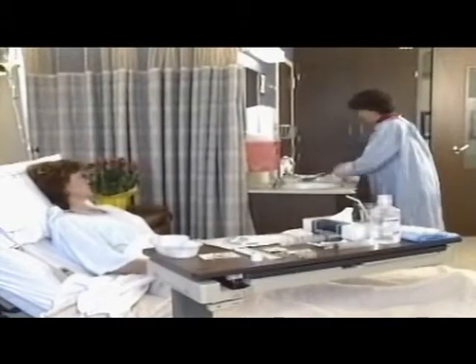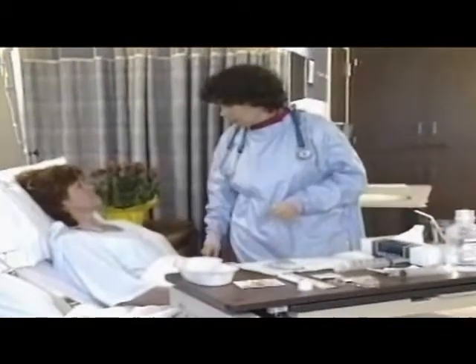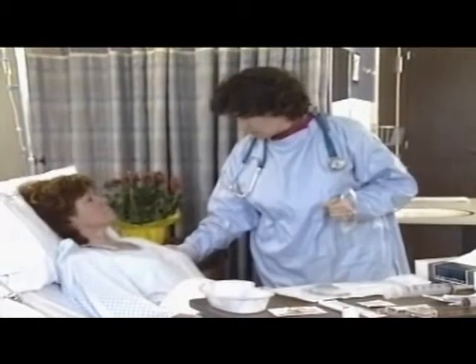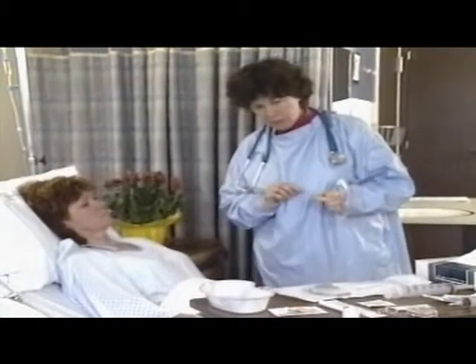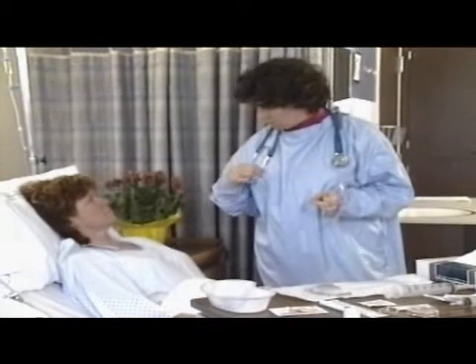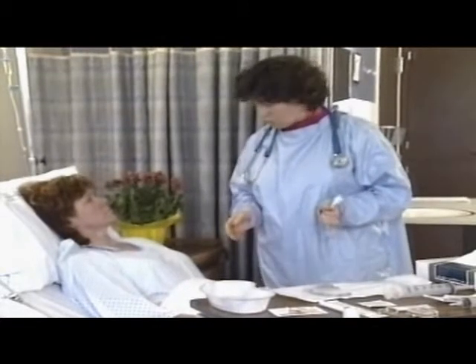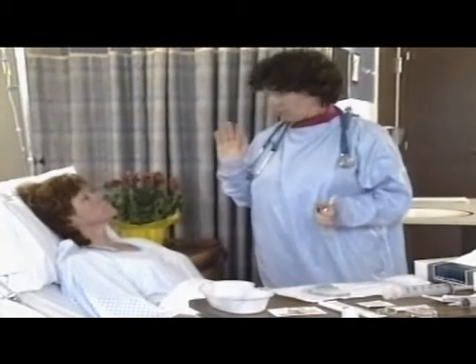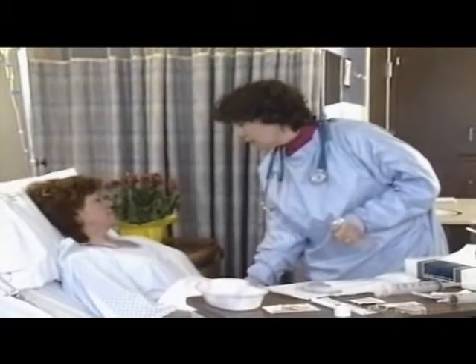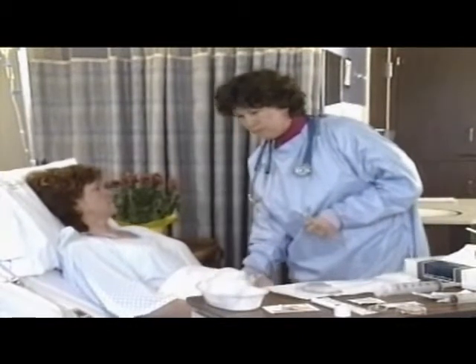Explain the procedure to the patient to reduce anxiety and promote cooperation. The tube will go down easily if you can help. I'll lubricate the end — it's a flexible plastic tube — and have you take a sip of water as it goes down to help swallow it into your stomach. If you have any distress at any time, just raise your hand so I can stop and we'll take a break. In advance, it is good to establish a distress signal with the patient in the event the procedure is not tolerated.